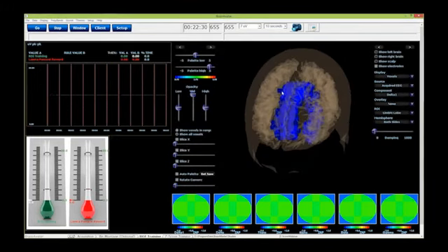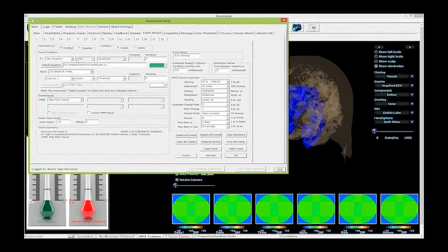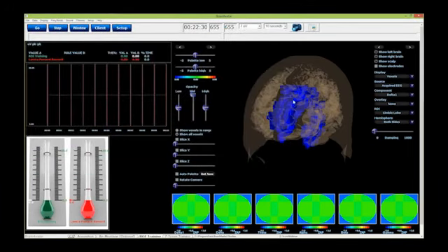All right, so here we go. Here's my little map. Here's my screen right here. Now, technically, and you can tell right here, I'm doing region of interest. I'm doing current source density training on this training right here. I'm not doing Z-score training. You can still view Z-scores on this head map right here if you really want to, if you switch the source to Z-scores.